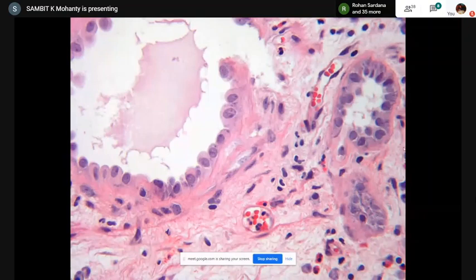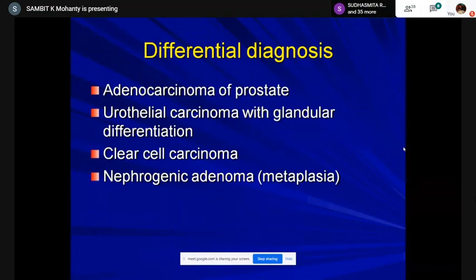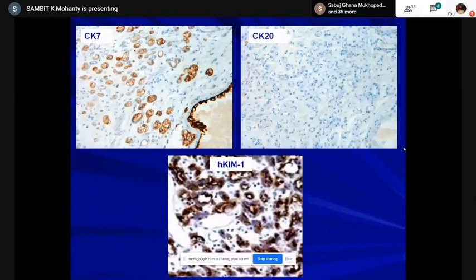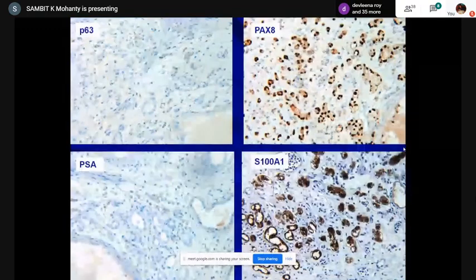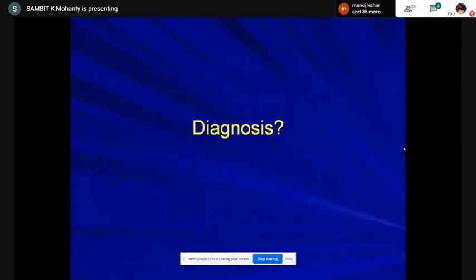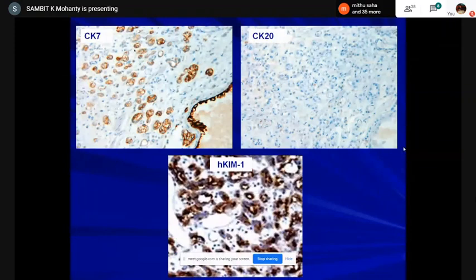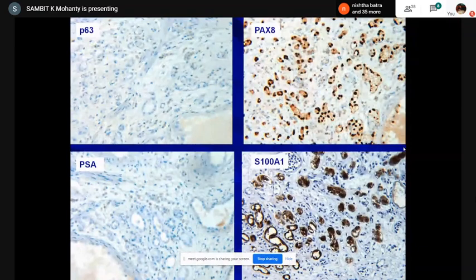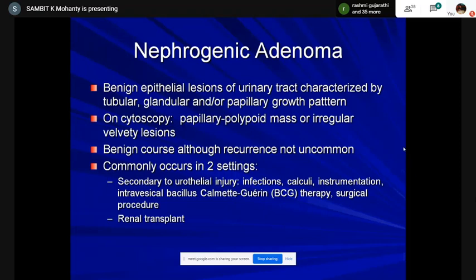My differentials included prostatic adenocarcinoma, urothelial carcinoma with glandular pattern, transitional clear cell carcinoma, or nephrogenic metaplasia versus adenoma — given the history of renal transplant. I did stains to cover all differentials. Positive for CK7; CK20 was negative; p63 was negative; PSA was negative; NKX3.1 was negative — so bladder and prostate were excluded. It was positive for human kidney injury molecule-1 (HKim-1), CK7, PAX8, and S100A1, which is a marker for distal tubule/thin nephron.